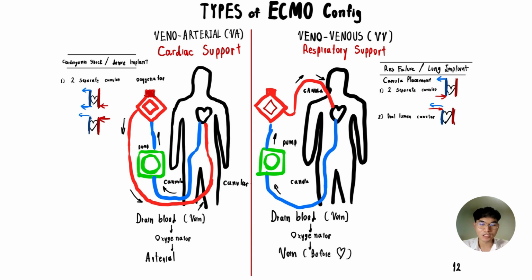To sum up, the careful placement of cannulas in both ECMO configurations is vital for ensuring the efficiency of extracorporeal support, minimizing mechanical complications, and optimizing oxygen delivery and carbon dioxide removal.